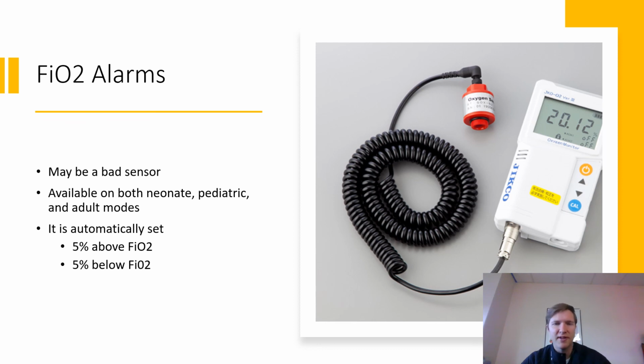If it was you or a loved one on the ventilator, you'd want someone to have appropriate settings. You'd want things to be caught sooner than later. You'd want someone to see hypoventilation before it goes to desaturation, right? You'd want someone to catch these things sooner than later. So these alarms, especially on life support machines, are an important thing to take care of. So hopefully you see the importance and the value, and make sure you go through your numbers, what percent above, what percent below, so make sure you review those.